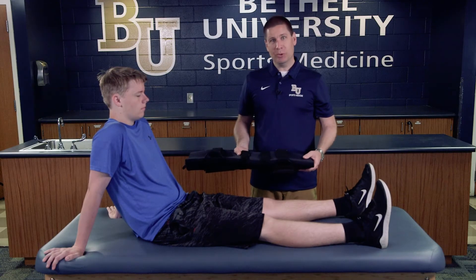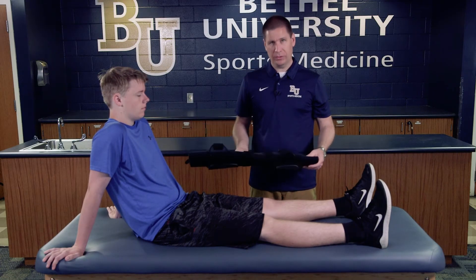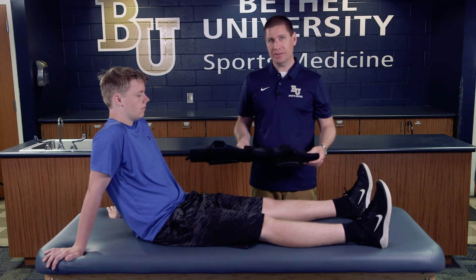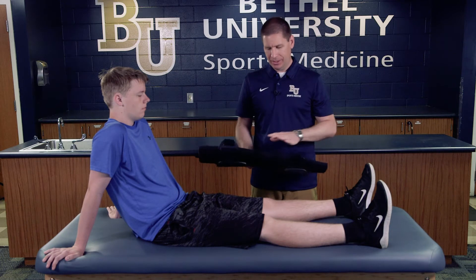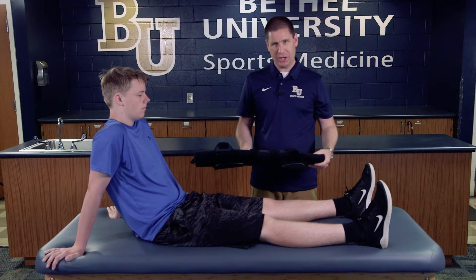Today we're going to be fitting a knee immobilizer. One of the first things you want to make sure you do is check the immobilizer to make sure it's the right size. They come in all kinds of different shapes and sizes.